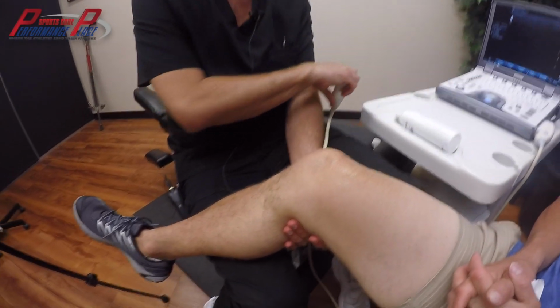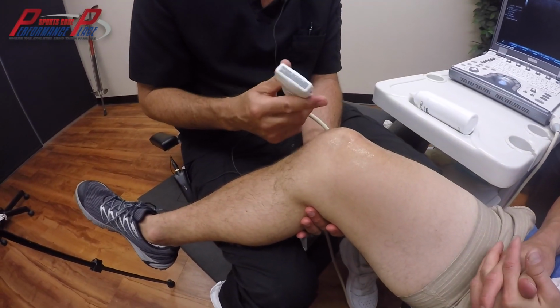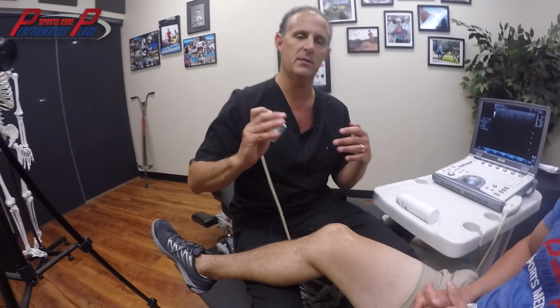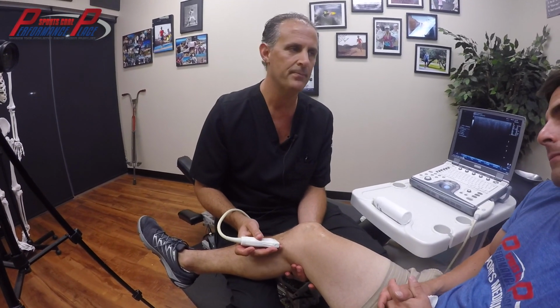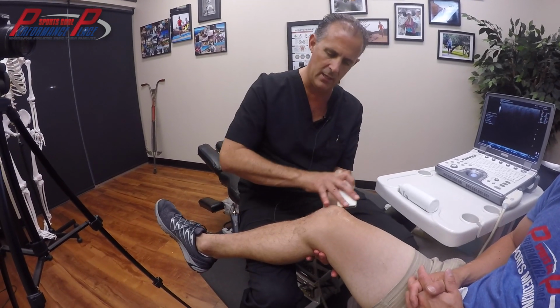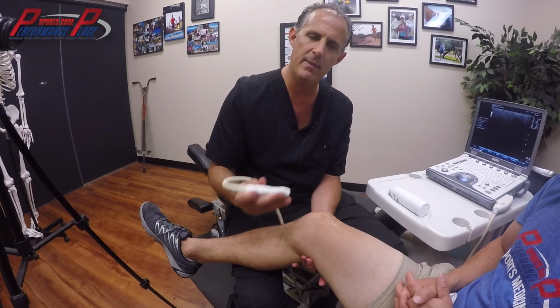So here we spent a good deal of time talking, but this whole exam should have taken about 5 to 7 minutes. If we were just going through this in a normal way, there'd be no talking here, and we would just be making our way around the knee, and in a matter of minutes we can come up with some really good answers. We can find out what we're dealing with and where the treatment course should go.